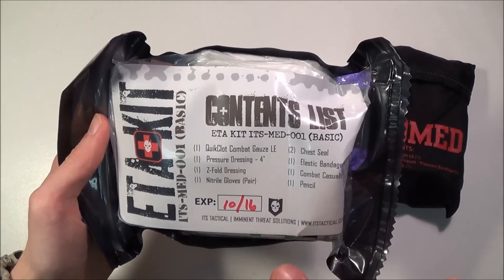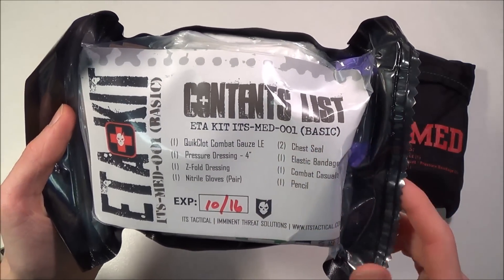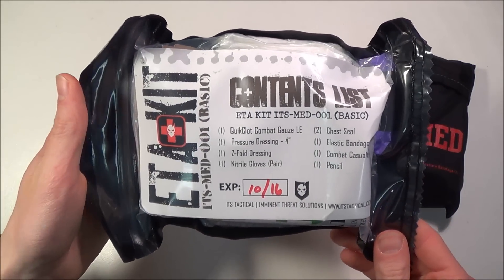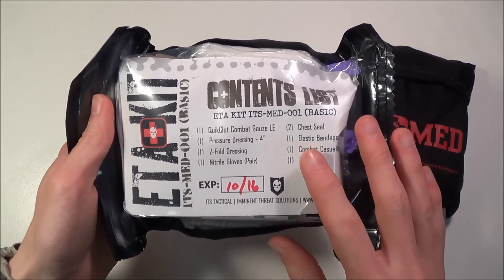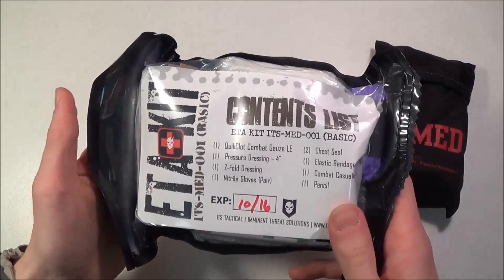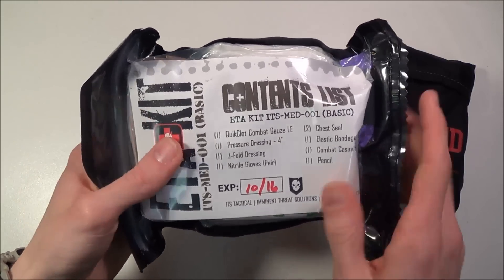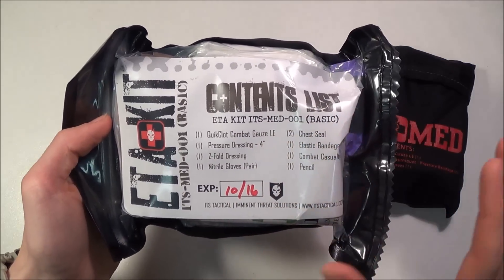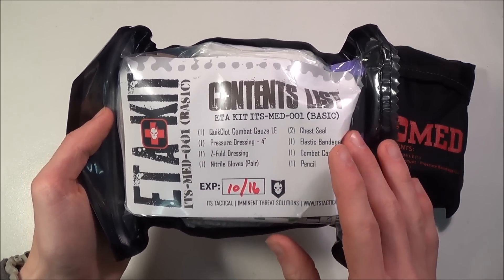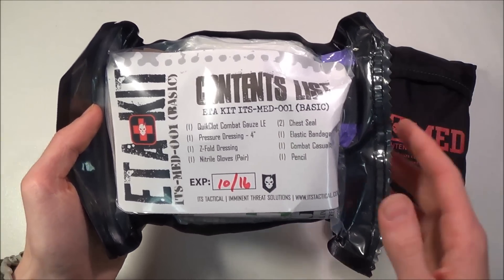The only difference between the basic and the standard is that the basic kit does not come with a nasal pharyngeal airway and a 14-gauge decompression needle. Now those two items — unless you're a medical professional such as an EMT, paramedic, combat medic, or corpsman — unless you have some medical training, you're not going to know how to use those. And if you try to use them, you could potentially severely hurt your patient.